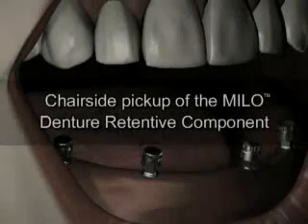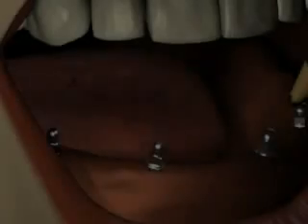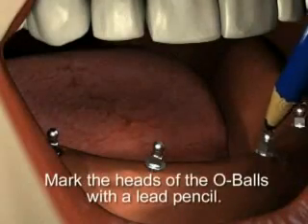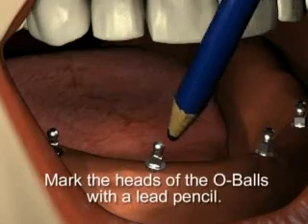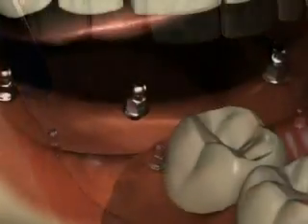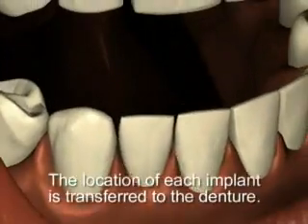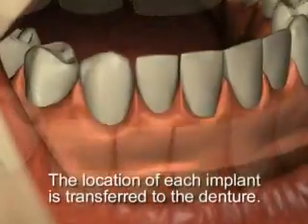For chairside pickup of the denture retentive component, transfer the position of the o-balls to the tissue-bearing surface of the denture by marking the heads of the o-balls with a lead pencil, or insert soft silicone or soft wax inside the denture. The location of each implant is transferred to the denture.